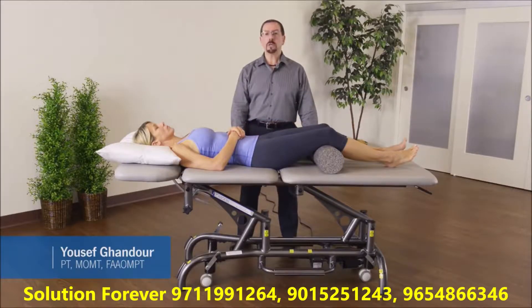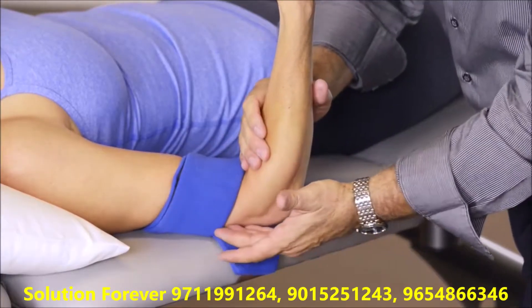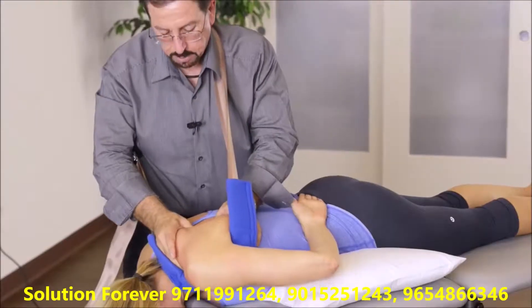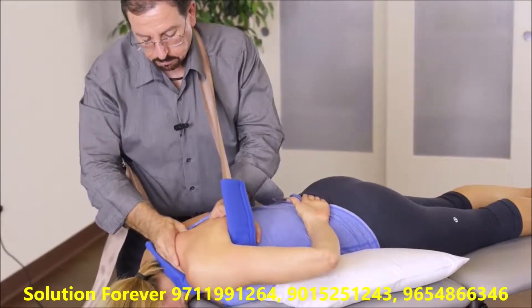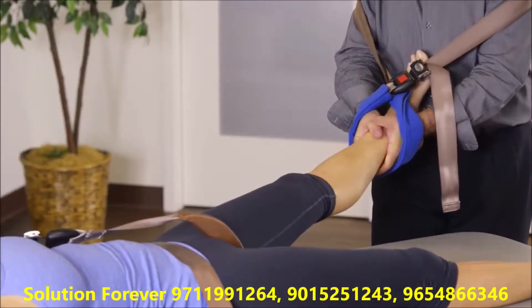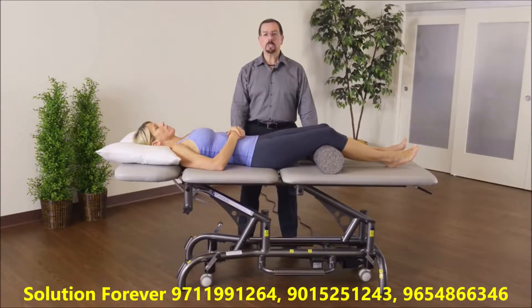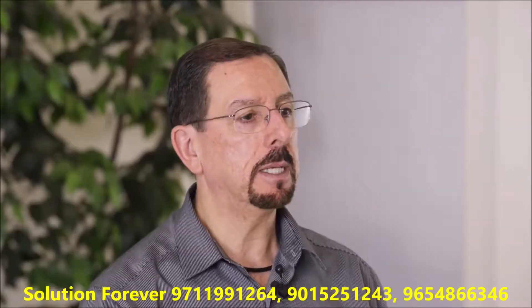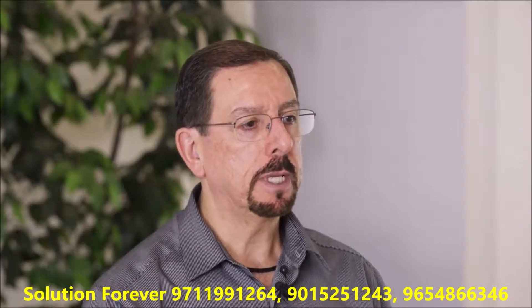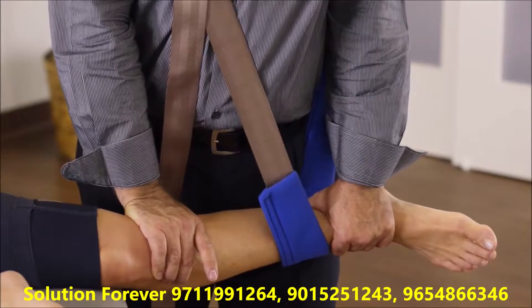For 30 years in orthopedic manual physical therapy, I've been using the mobilization belts for many years and found it to be a very effective tool to give us optimal outcome in our treatment. In manual therapy, our goal is to be very specific in addressing certain joints. We use the mobilization belts — one is to stabilize one part of the joint, the proximal joint, as we mobilize the other or distal joint to get more specific and get optimal outcome for joint mobility.